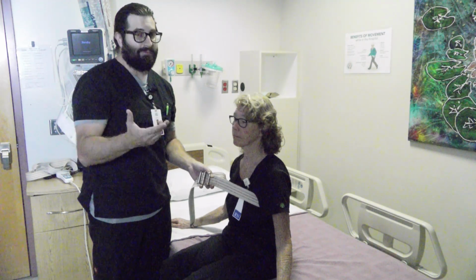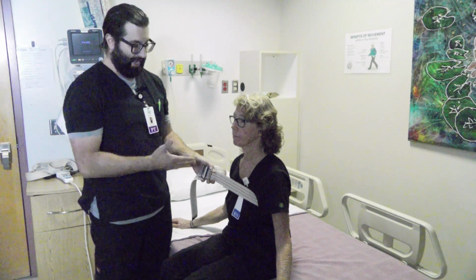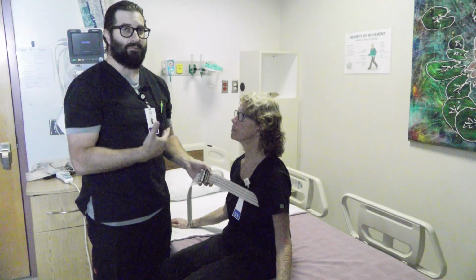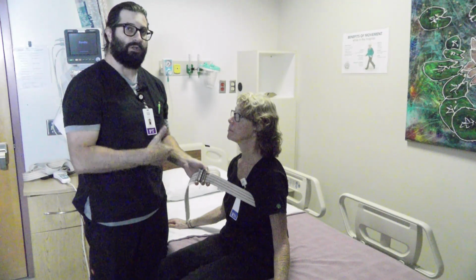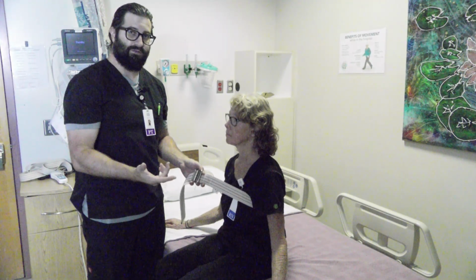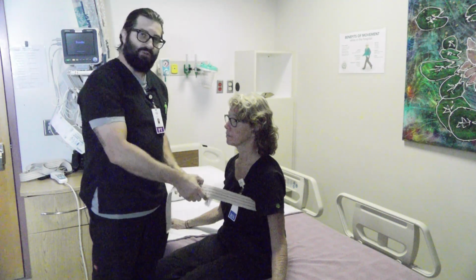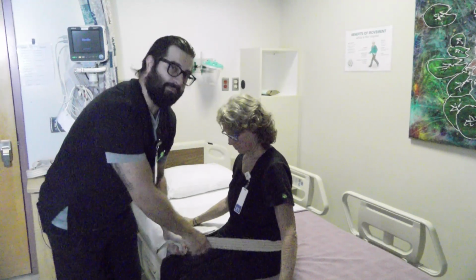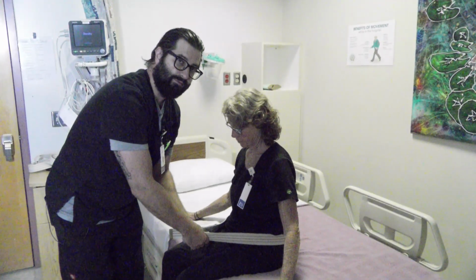Now, there might be times to put it there if an individual has had stomach surgery or they have a colostomy bag or some other medical device down in that area that would preclude you from putting it there. But normally we want to have it around the waist. So what I'm going to do on Patty is I'm going to go down lower, make sure it's down around the top of her pelvis or in that area, okay?